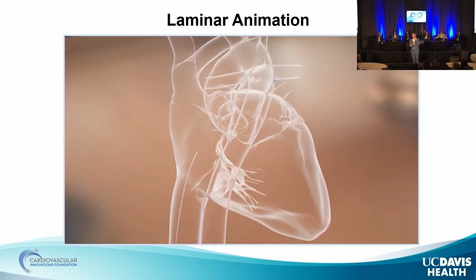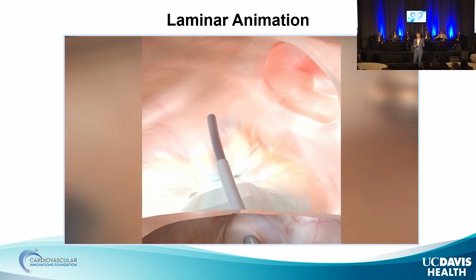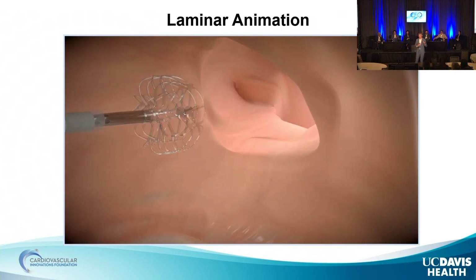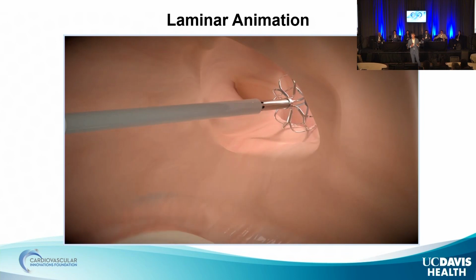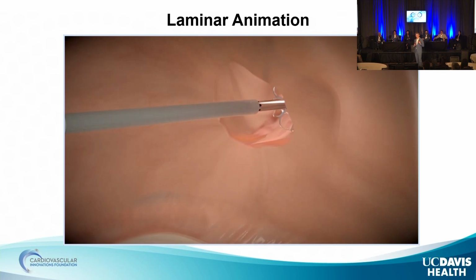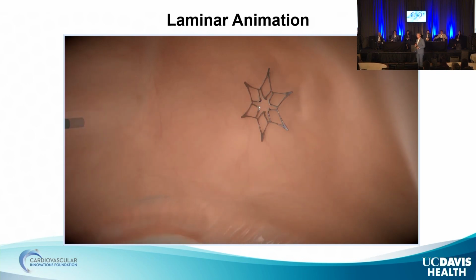This is the animation. The approach to the appendage is really the same. We do a consistent inferior-posterior puncture. We don't really tailor mid-mid or inferior mid because it has a steerable guide that allows us to steer the device. We really come in the center and very orthogonal and just touch the back wall. We don't go into the appendage very deeply, and when we rotate, it closes, and then you can deploy the lock. Up until this point, this is all reversible, and you could remove the device up until the moment of release here. And like a bare metal stent, at least in animal studies, we know this heals very, very quickly.